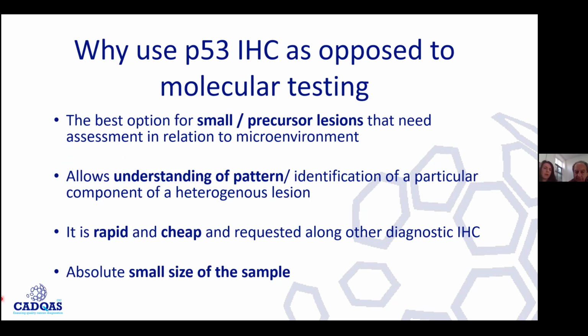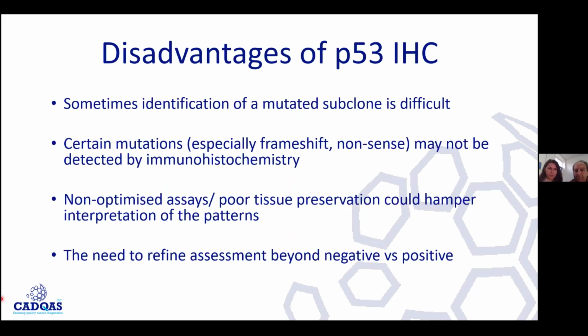Yeah. And for some of these questions on whether something is potentially a tumor or potentially dysplastic or potentially low grade, et cetera, the cost of sequencing depends on how many companion diagnostic immunohistochemistry you need to put.